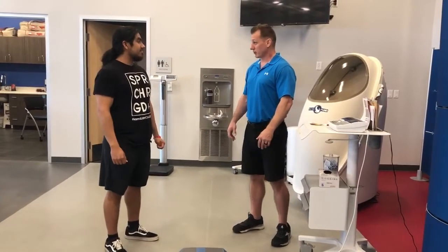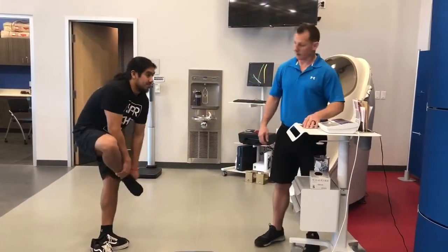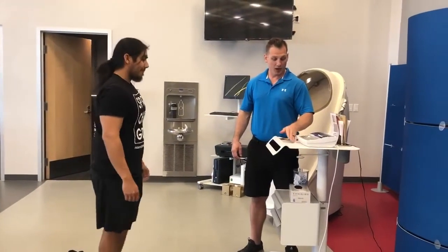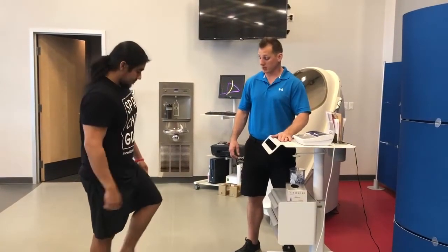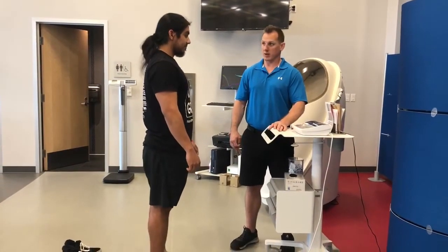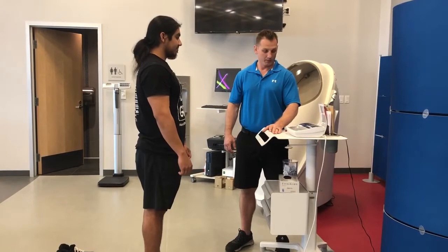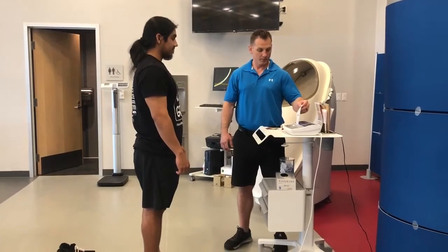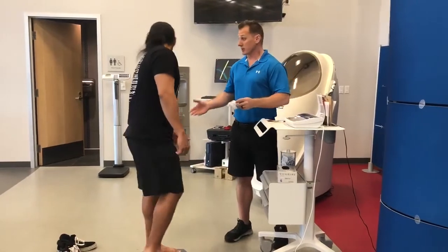Darius, I'm going to do your Tenita Bioelectrical Impedance. The first thing we need you to do is take off your shoes and socks. We've entered in your body type, your gender, your age, and your height, and now this scale is telling us that it's ready for you to step on. Step on and stay on the scale until I have the printout. Try to stay as still as possible — the scale is a little sensitive, so we want to make sure we get your weight. Go ahead and put your shoes and socks on, and we'll go over the results.